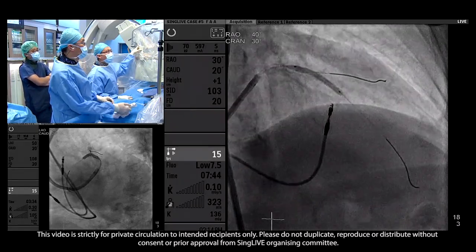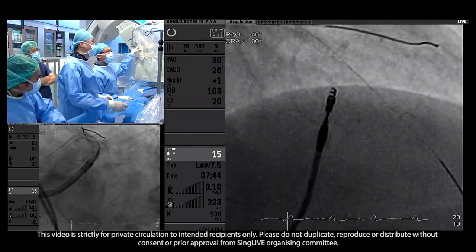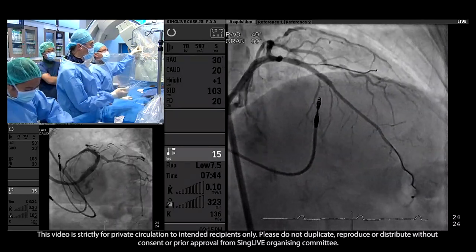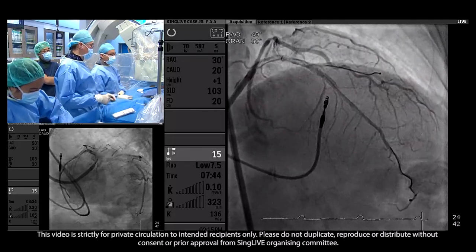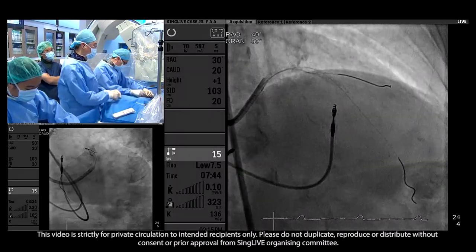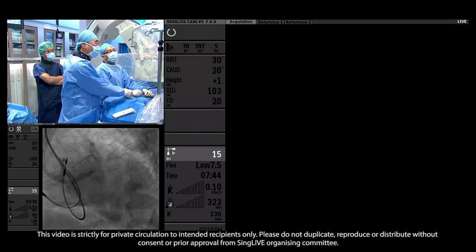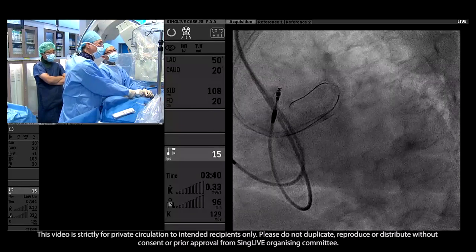Were the panelists surprised that it actually expanded quite well, even though there was so much calcification? Definitely. I think when you have this quality of imaging and the eccentricity of the calcium, the stent expands in the soft part of the vessel, so you are displacing the eccentric calcium. You may not be modifying it, but you are displacing it. So I think balloons expand in that situation because of the distensibility of the normal vessel.